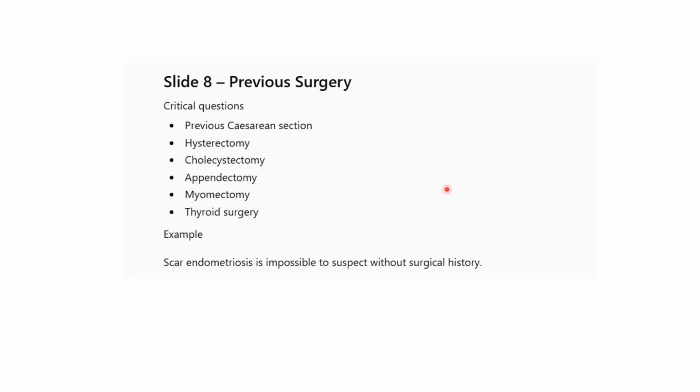Initially, I was very foolish. I wrote a report saying that the gallbladder was normal. You know, when you're using report templates, you don't edit. Yet the patient had a cholecystectomy 3 years back. It was very embarrassing of me.